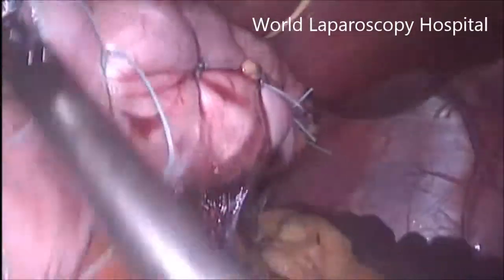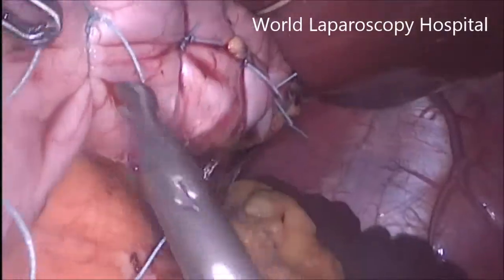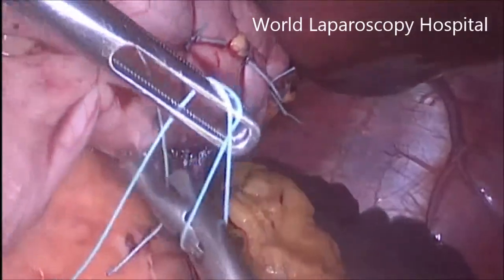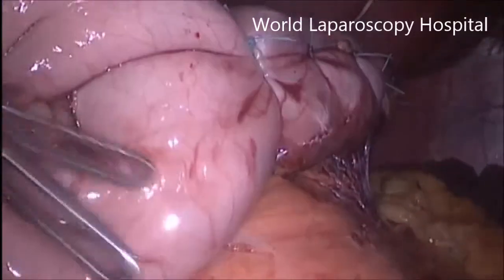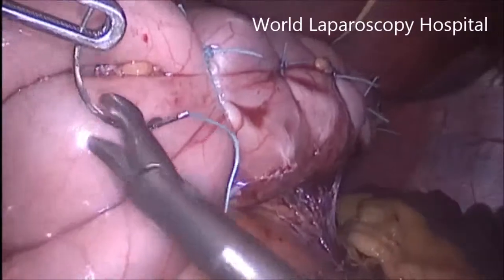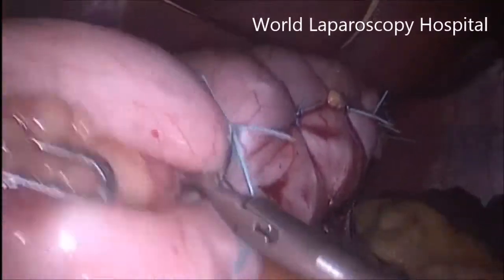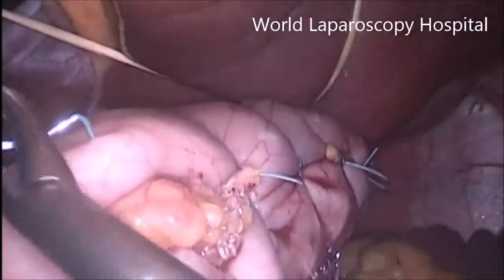Now this is another layer. Interrupted sutures have to be continued up to 4 centimeters from the pylorus. It is better to have a 3 wrap of the suture because it is under tension. So after taking the bite, when you are using the surgeon's knot, the first time it should have 3 wraps instead of 2 wraps. That will give you a better grip and it will not slip.